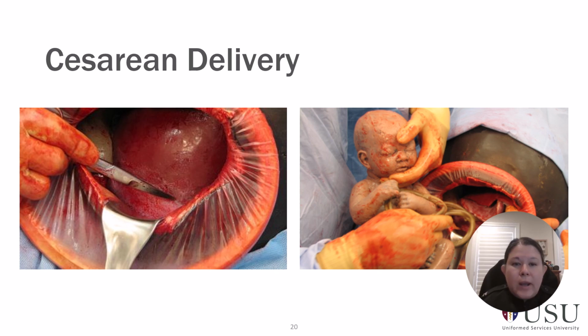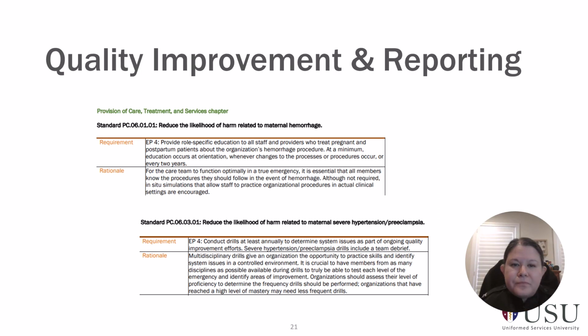And then a variety of different simulators for cesarean delivery. This one's an operative experience simulator where you can practice the uterine incision and the fetal delivery, which are great options for both in situ and simulation lab simulations. So in terms of quality improvement and reporting, this is now sort of a requirement by the Joint Commission to not only provide training to people, but also to include multidisciplinary drills.